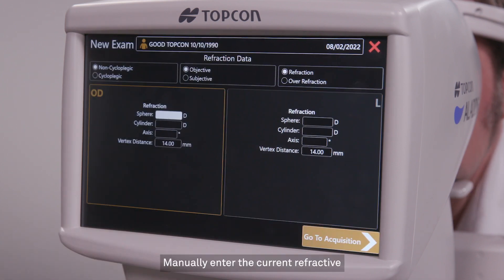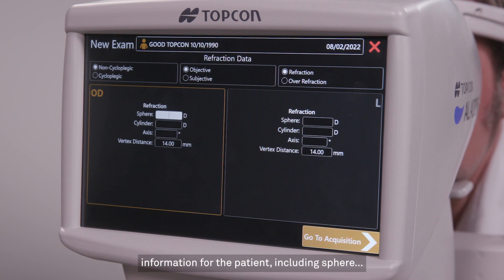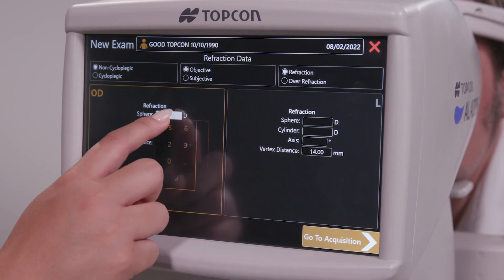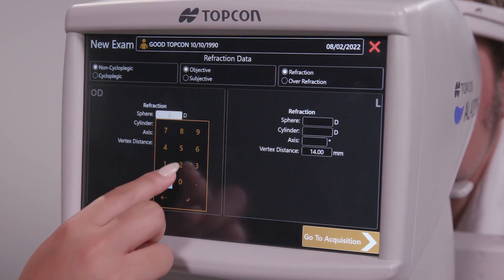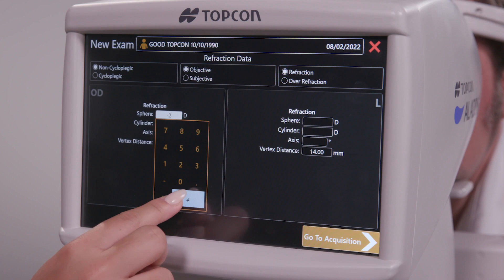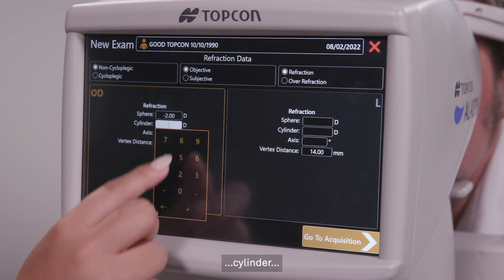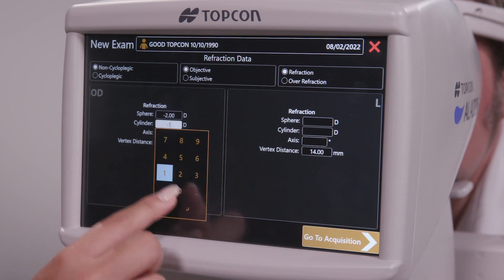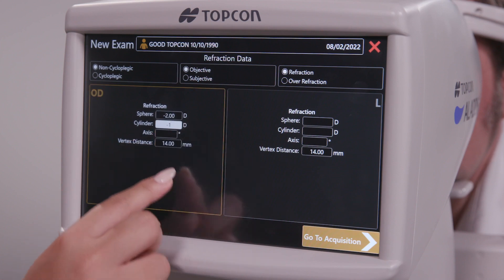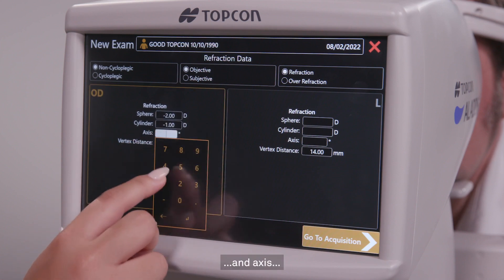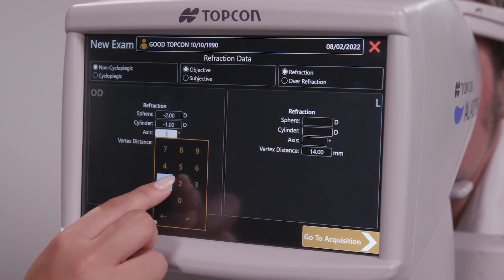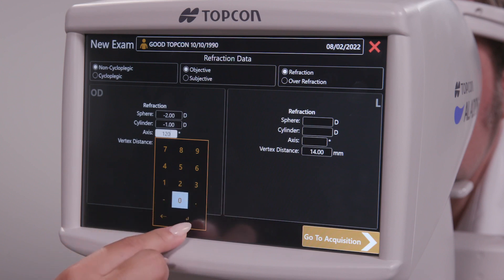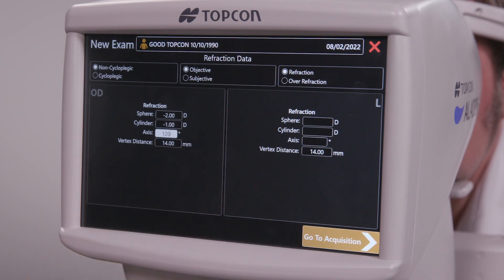Manually enter the current refractive information for the patient, including sphere, cylinder, and axis for each eye.